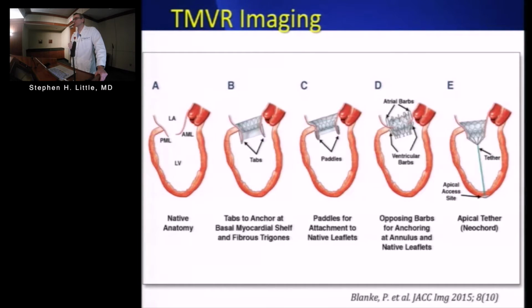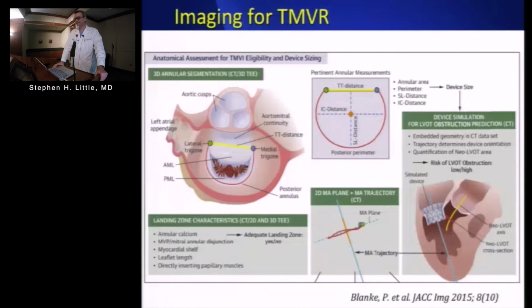So it's a big issue in terms of dealing with the anterior leaflet and avoiding SAM, and that comes down to the aortic-mitral angle, the septal thickness, the length of the device, and the length of the native leaflet. That's the predicted Achilles heel of this procedure really: anchoring and disruption of the left ventricular outflow tract. And there's a lot of work being done in that field now.